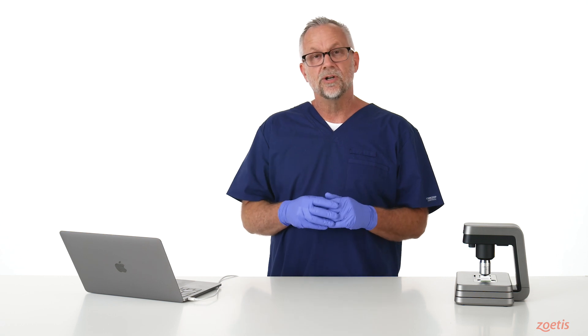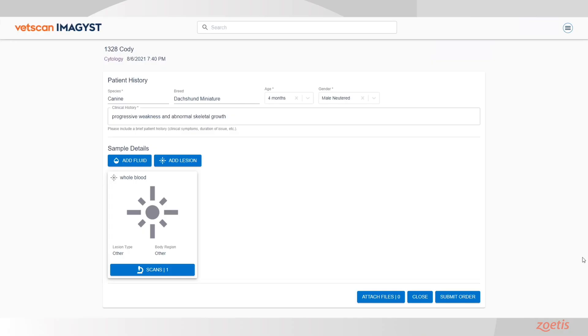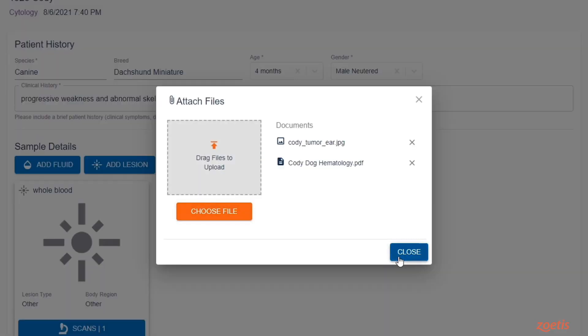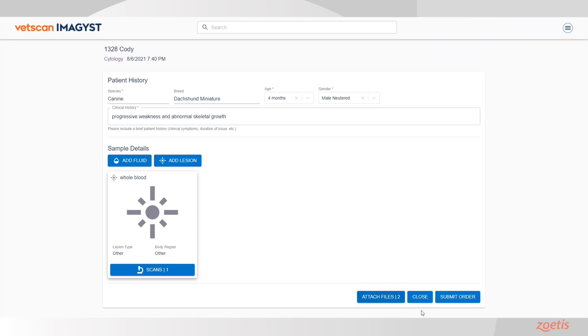Prior to submitting the order, you can attach additional files that the pathologist might find useful. Click Attach Files and upload any JPEG or PDF. When those files have been uploaded, click Close and then click Submit Order.